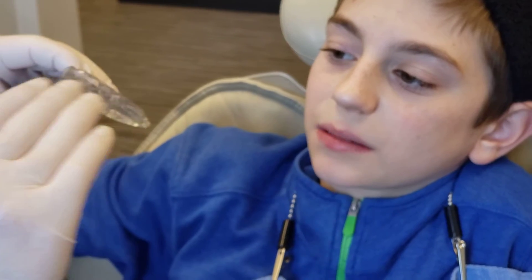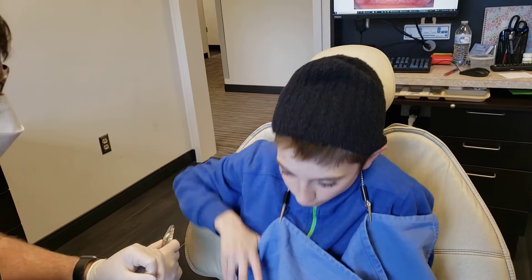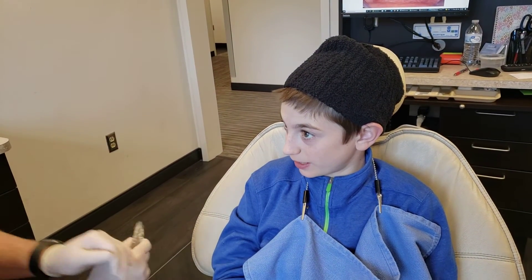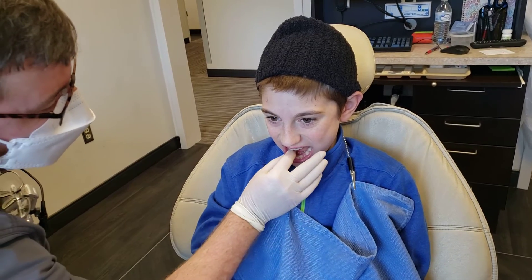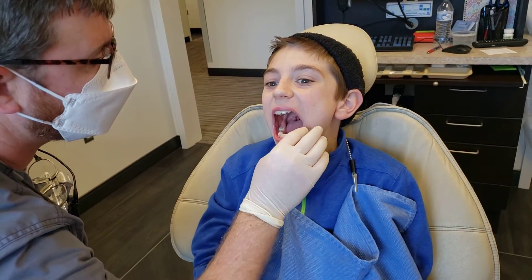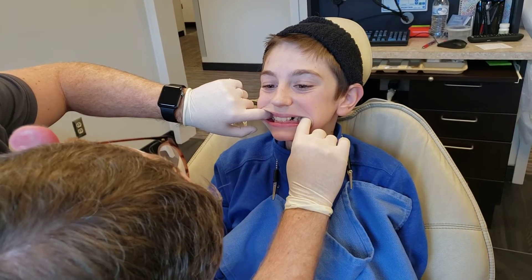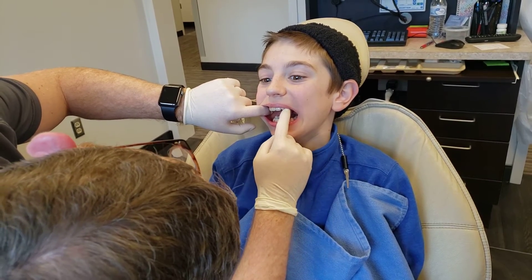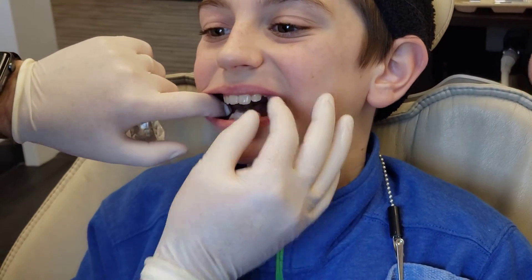As those permanent teeth start to come in, the stops put the teeth in an ideal alignment. Why am I losing my teeth? Well, maybe because you're eating candy? Halloween — two pieces a week. I bet you're losing teeth because it's time for them to come out. The tooth that's going to replace this one is coming in — it's bigger, so it'll fill in that space.